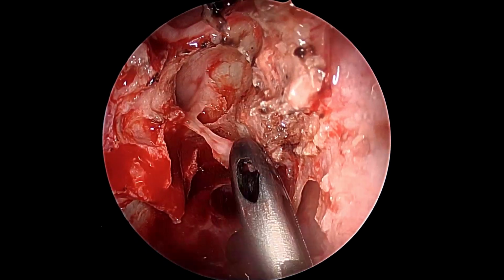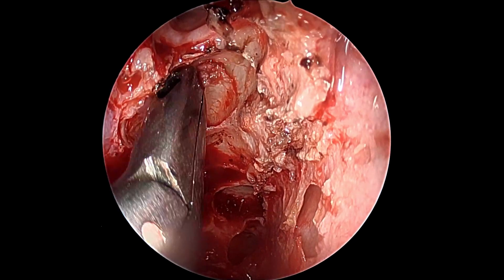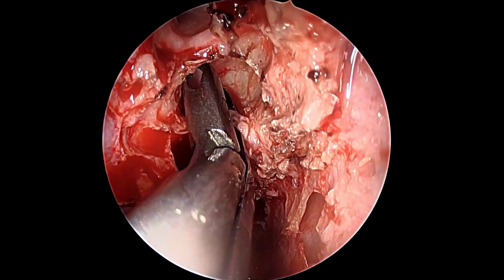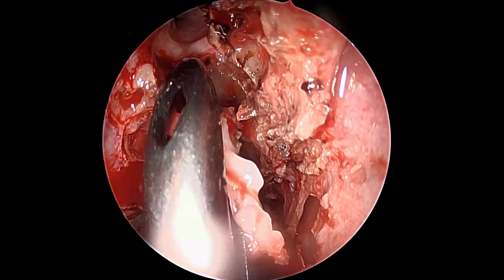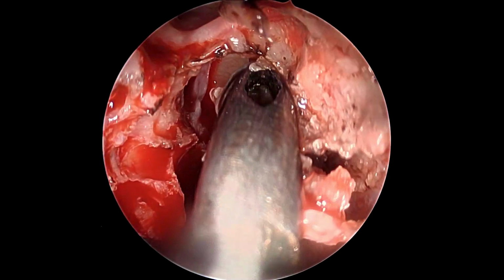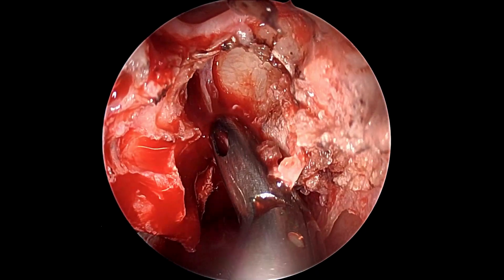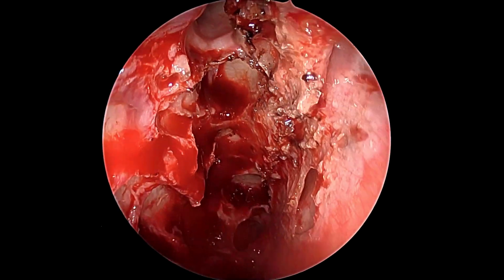So we clean here some more mucosa from the base of skull. If we leave this mucosa behind, there is a fair possibility of formation of mucoceles, which would later on give rise to trouble. So just like I said previously, all amount of preparation must be done before we actually come to the step of actual graft placement.